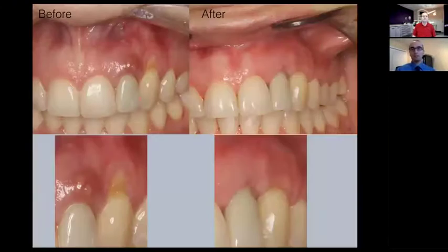So we saw the patient, and this case, this is about 4 weeks after the surgery. As you see here, I also did the connective tissue grafting at the same surgery to achieve the root coverage. So I assume that this surgery has gone very successful because we managed the infection. The gingival margin looks healthy. There is no sinus tract, and we got a very good root coverage here. And as you see here, because of the resolution of inflammation, we got a slight amount of gingival margin recession around the implant. This should have been communicated and has been communicated with the patient.